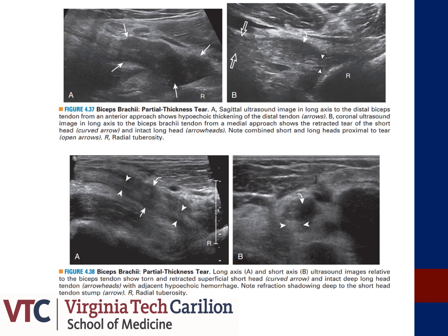These images represent a partial thickness tear of the biceps tendon. Both demonstrate a tear of the short head and an intact long head. I think the best image to see this is figure A, where you can see the intact portion attaching to the radial tuberosity and you see the torn short head.